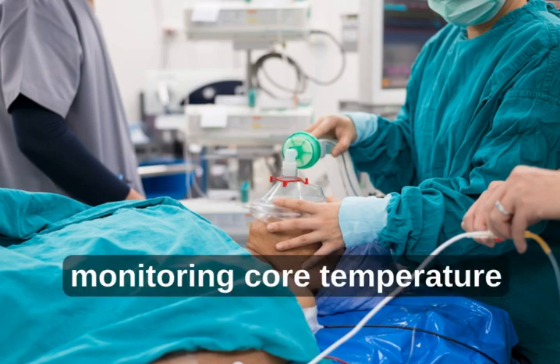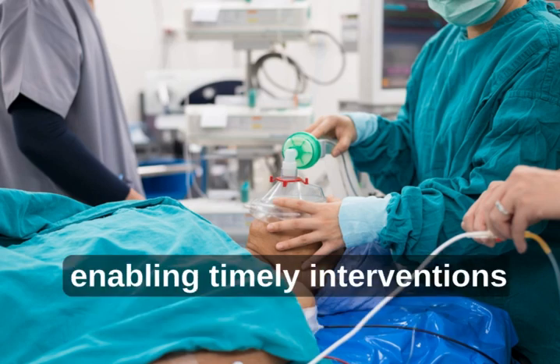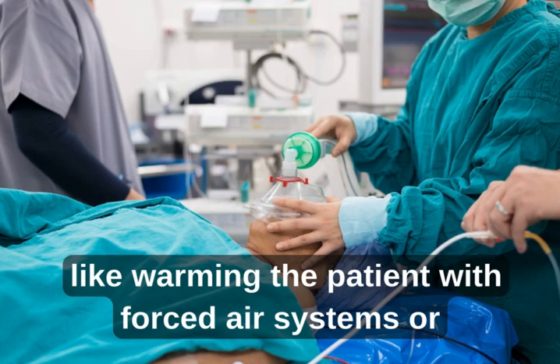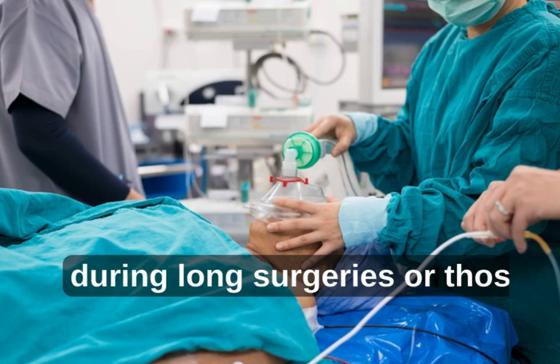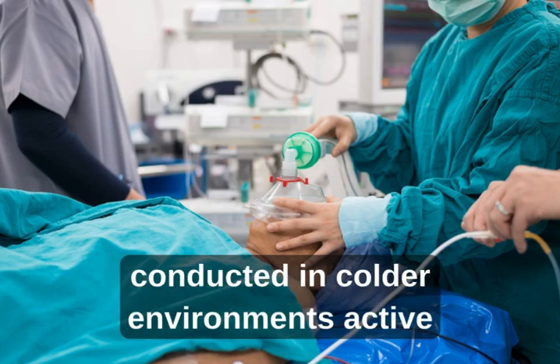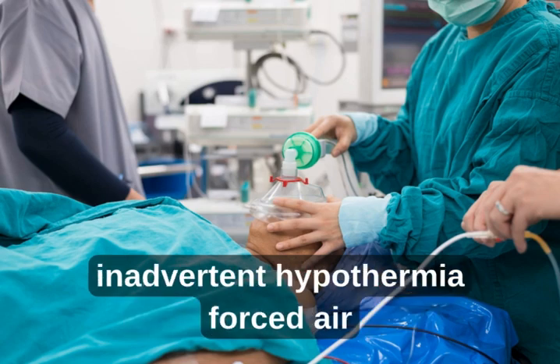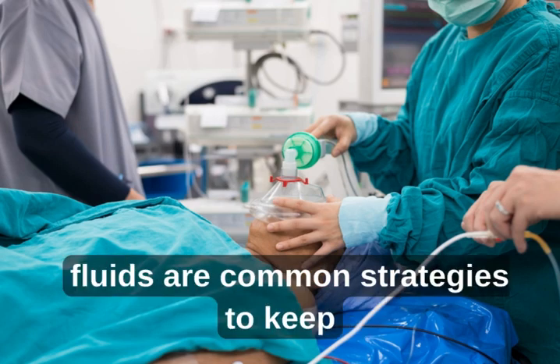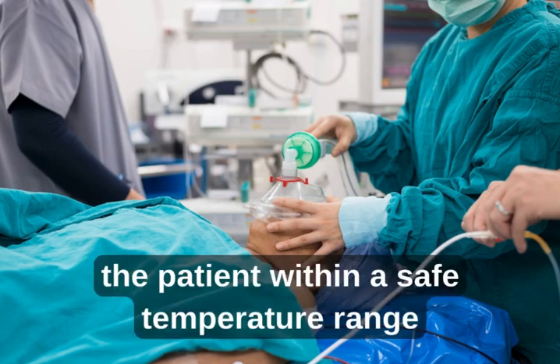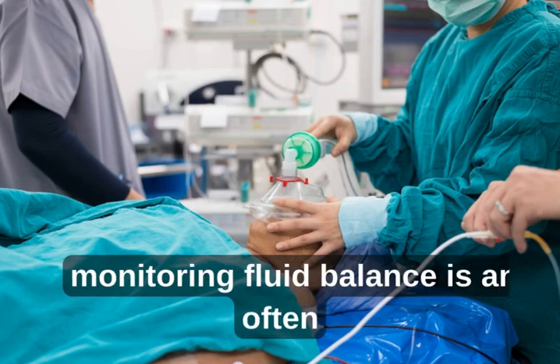Monitoring core temperature allows us to detect temperature drops early, enabling timely interventions like warming the patient with forced air systems or warmed intravenous fluids. During long surgeries or those conducted in colder environments, active warming is necessary to prevent inadvertent hypothermia. Forced air warming blankets and warming of IV fluids are common strategies to keep the patient within a safe temperature range.